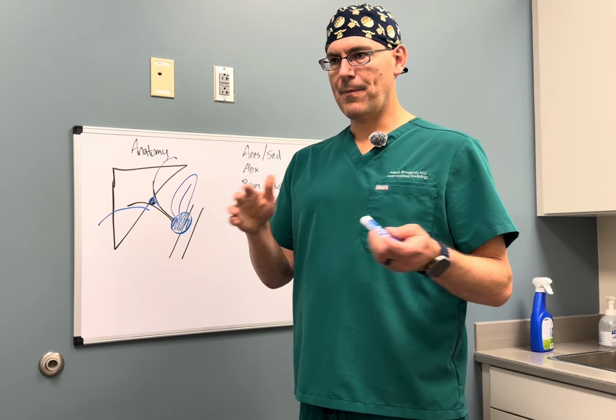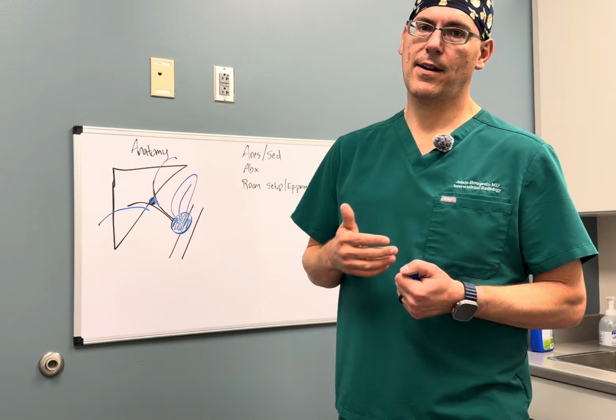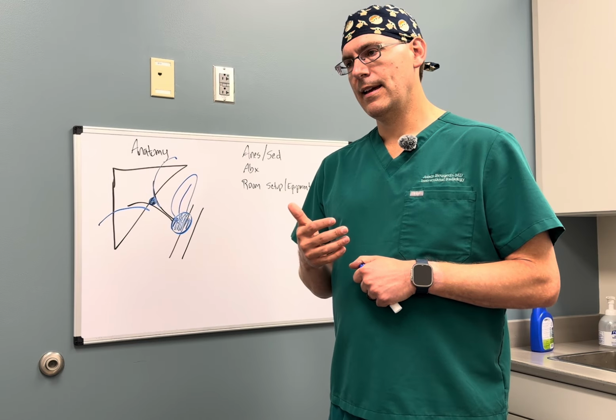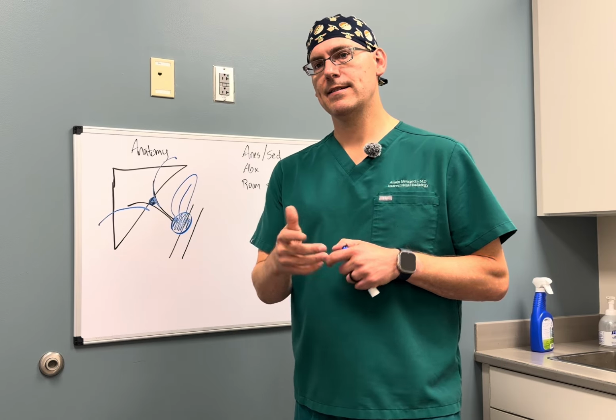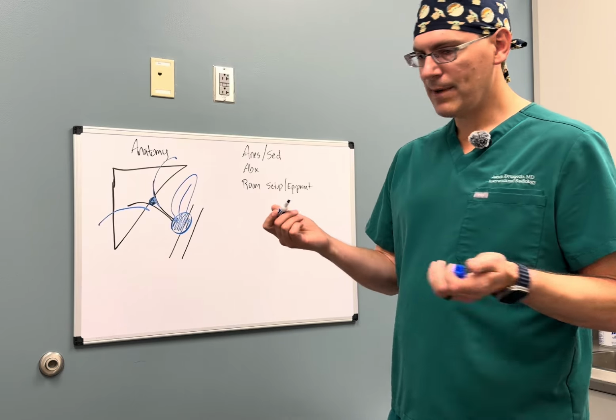And then depending on the pattern of obstruction, we would then eventually, hopefully, talk about removing those drains and replacing them with stents. And the pattern is important because it would let us know whether we could put metal stents in a Y formation or plastic stents. And so how do we differentiate that?